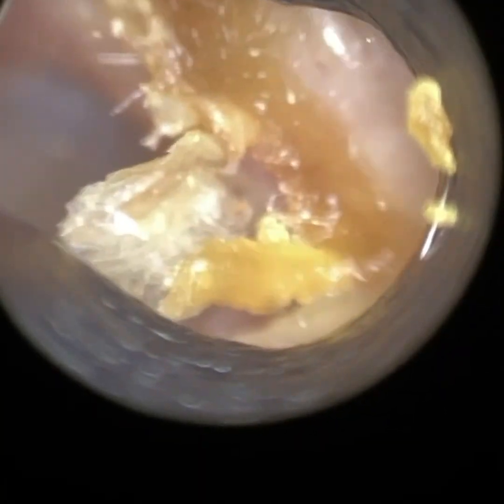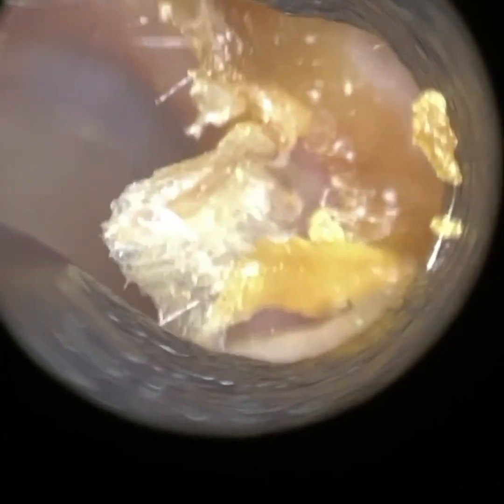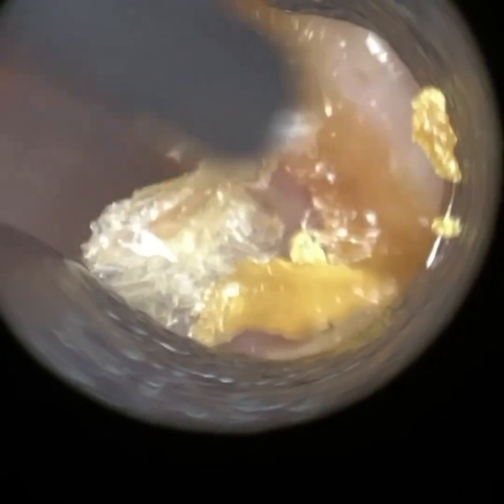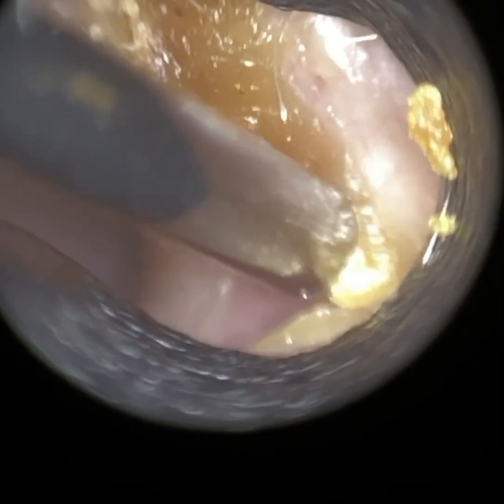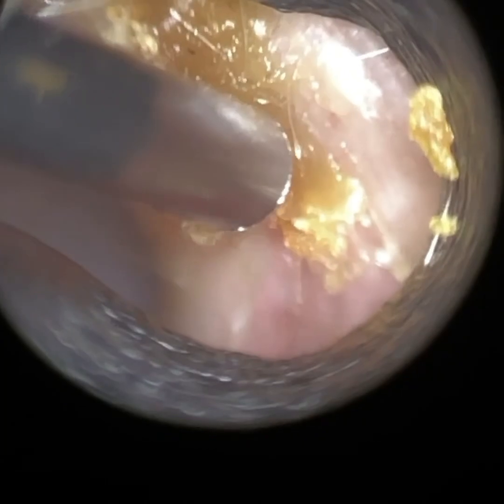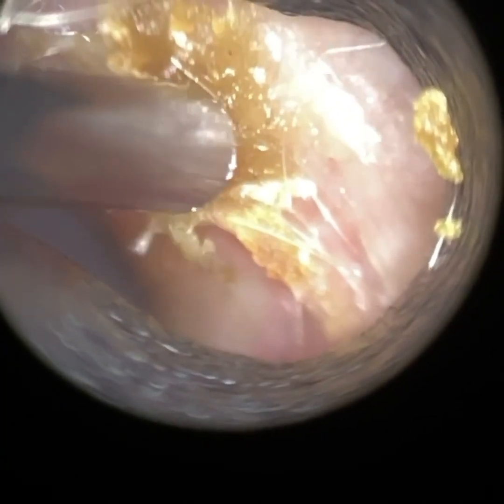What's great normally with the endoscope — the iCleoscope — is the view we get. You can see all of this around the edge; it's on the canal wall. And because of the reasons why we're removing it, to prevent acoustic feedback and to prevent the wax guard from chronically getting blocked, we've got to be really gentle.